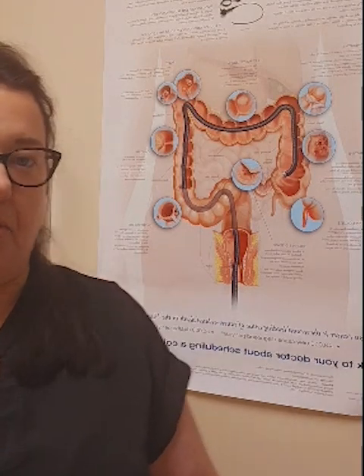Also, post-surgery, oftentimes you are released to home, and then home health is set up for you. Home health nurses will be coming to visit you, and they'll also be giving you more ostomy education, and they'll be helping you change that bag and getting used to the ostomy skincare and then appliances. They also have samples of appliances and what may work best for you.